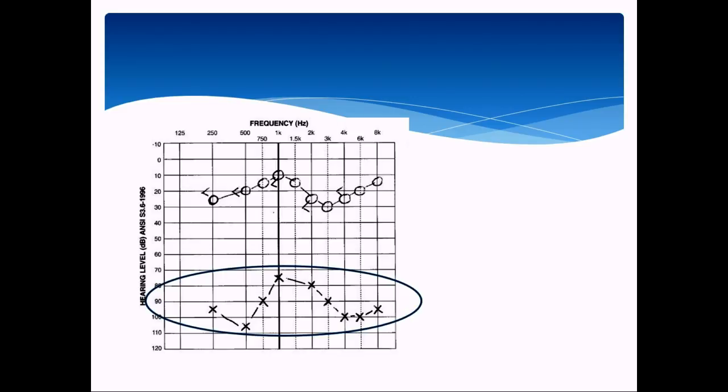This is a great audiogram. This audiogram is showing you a really important concept in masking. So none of the thresholds are masked. You can tell because the unmasked symbols are used. And you can look at an audiogram like this and figure out what transducer was used.